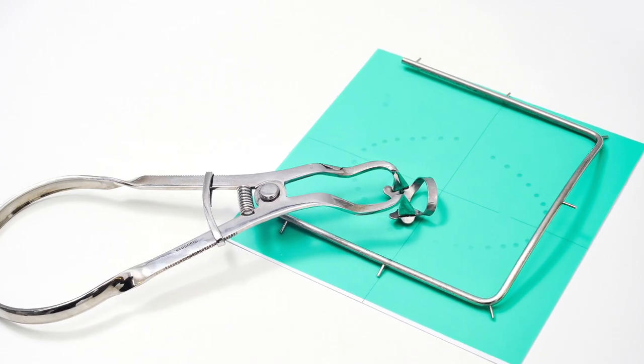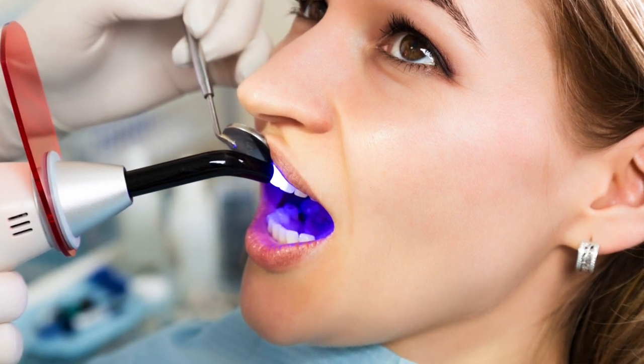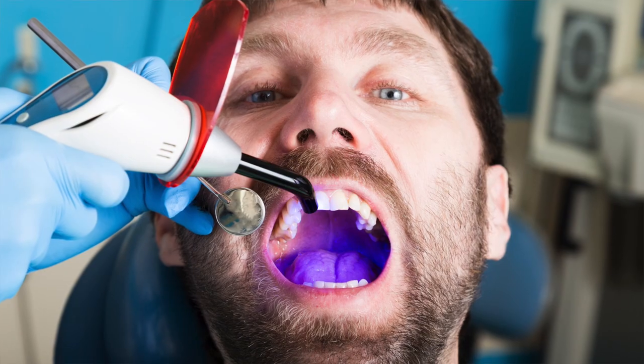If you think about a typical composite restorative procedure, there are a lot of steps and many opportunities for things to go wrong — everything from isolation, prep design, how you use your dentin bonding agent, how you place your composite, how you light cure your composite. One of the most important steps that we probably overlook from time to time is the light curing step, and when I observe providers and assistants doing the light curing step, there are many opportunities for improvement.